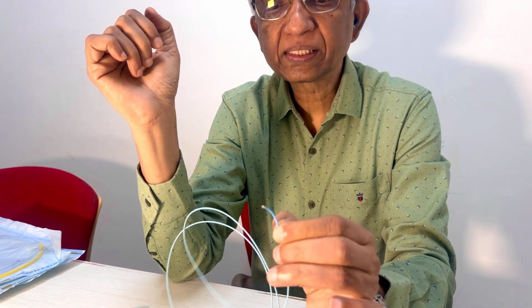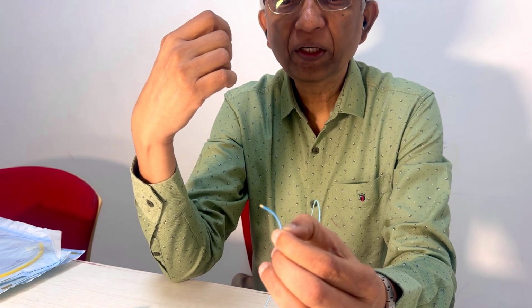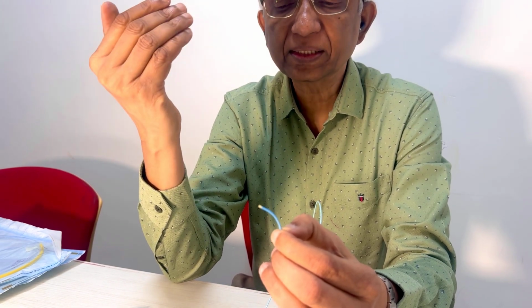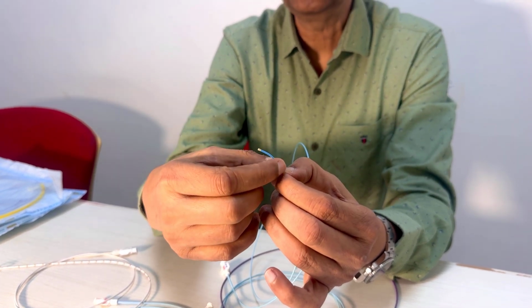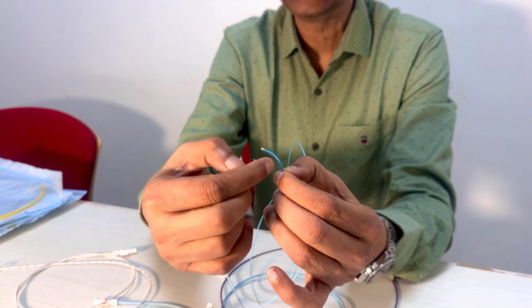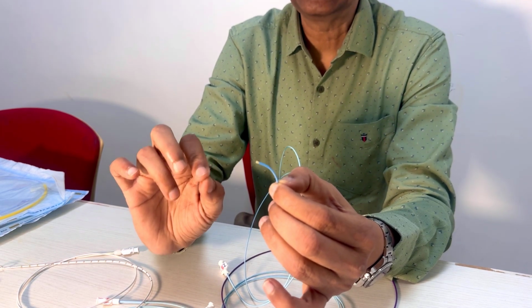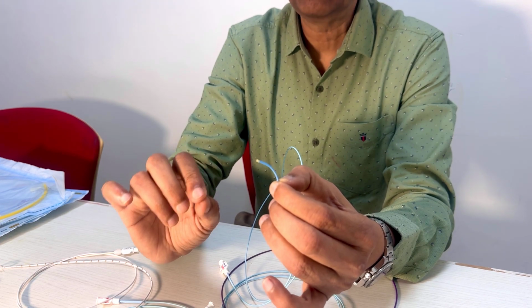Whereas there are some catheters that have two holes on the side also. Typically, these two holes are given so that if you engage the ostium, you can see in the main vessel as well as the side. Now, it's important only for one reason. If you want to inject particles for embolization, never take a catheter with side holes because particles will escape from the side holes. You got this point? It always has to be a single hole catheter which comes out from the tip. It's a fundamental. Never forget that.